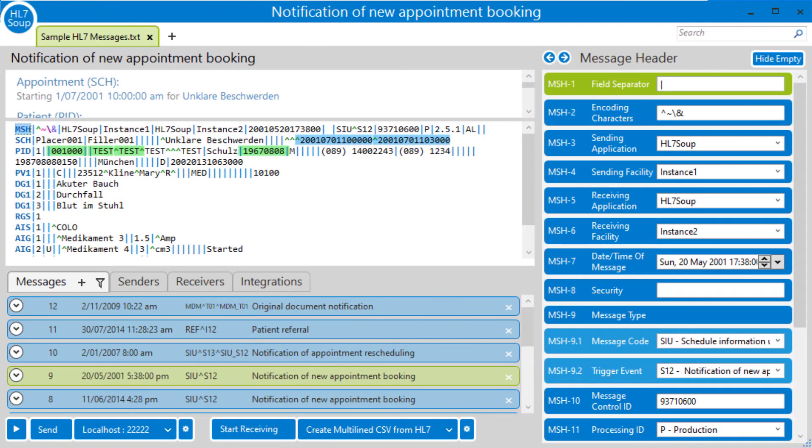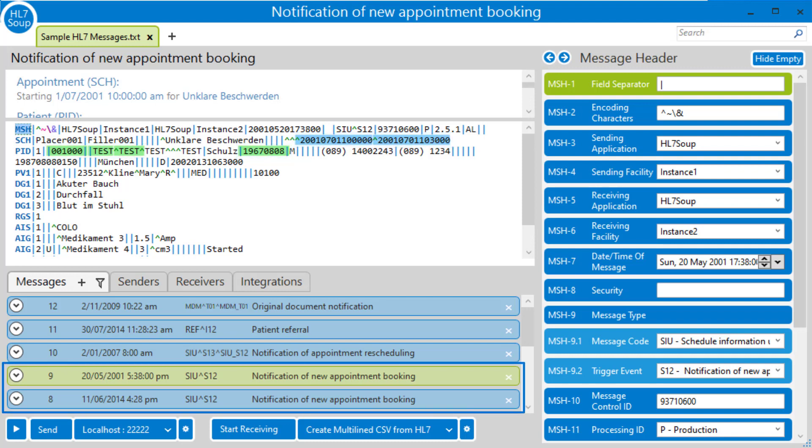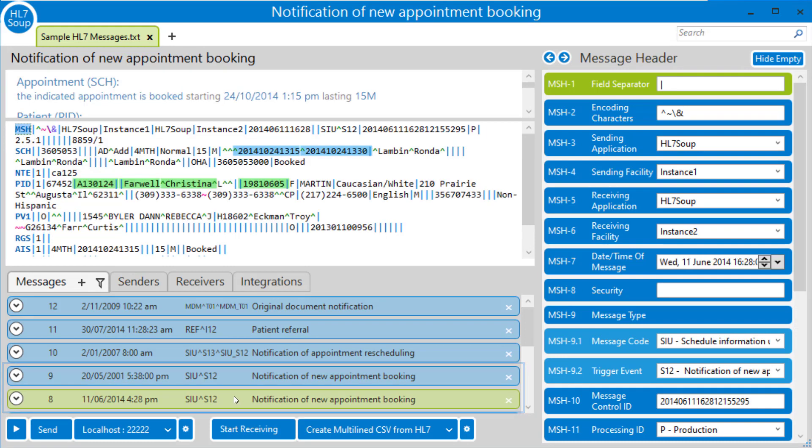Let's head over to HL7Soup and take a look at an SIU S12 message and at the fields that we'll be extracting. I've already added some highlighters to indicate which fields we'll be using. And you'll see we've got a couple of SIU S12 messages as the first one and the second one.